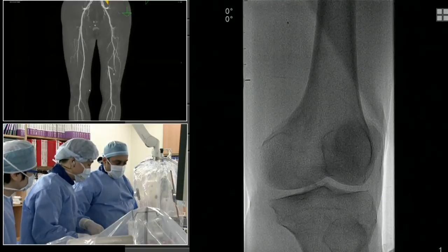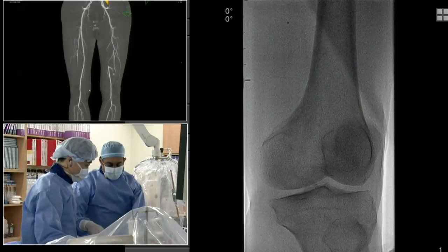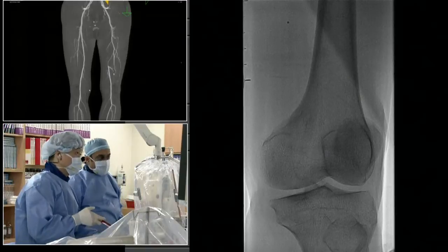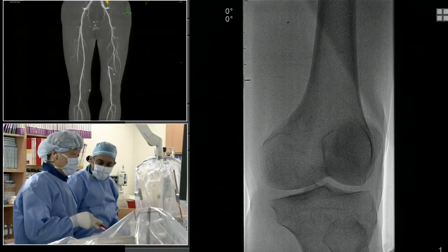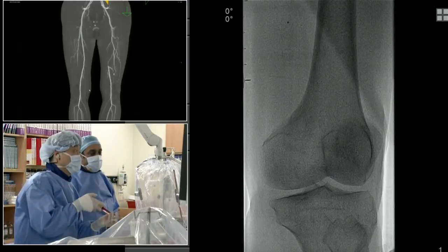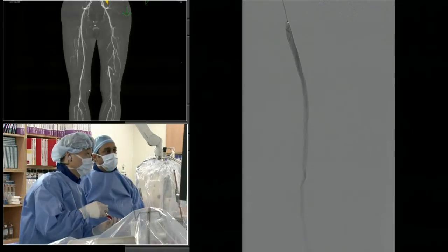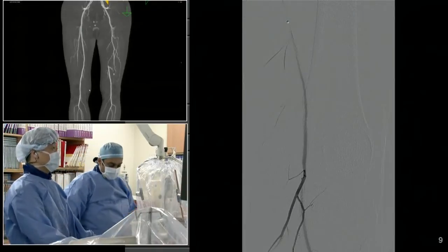Ravish, if you show us a shot that shows you're in the distal vessel, we may go to the other room. Perfect. Sounds like you don't need our help at all, and you're doing a fantastic job. Got a non-calcified, straightforward SFA. It's still a long lesion. Very good. You made it look very easy. There we go. We're happy on this end. I'm sure you're happy on your end.